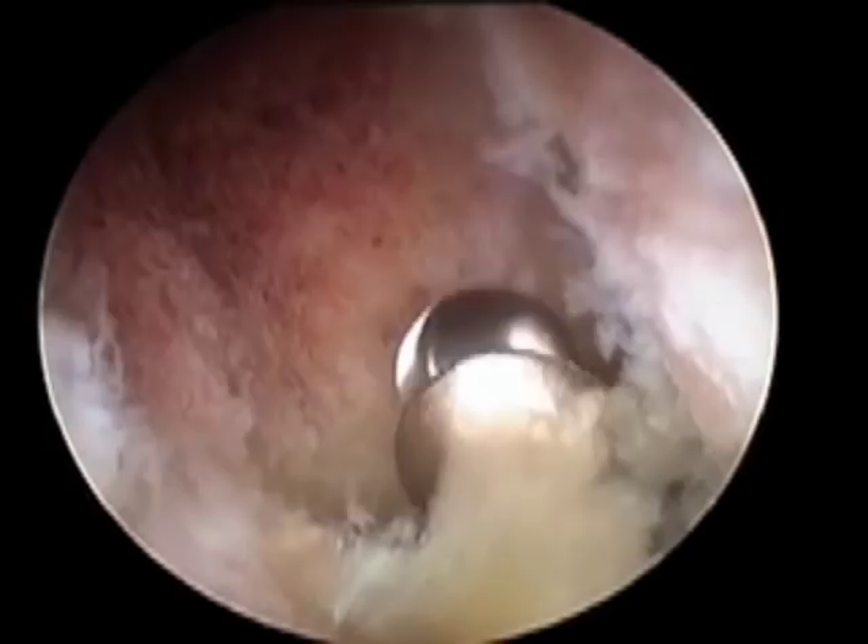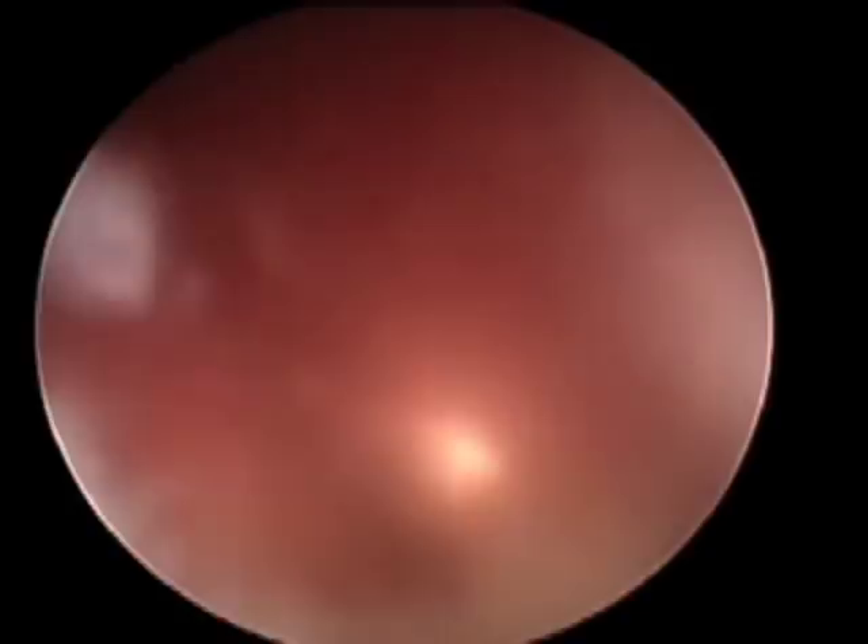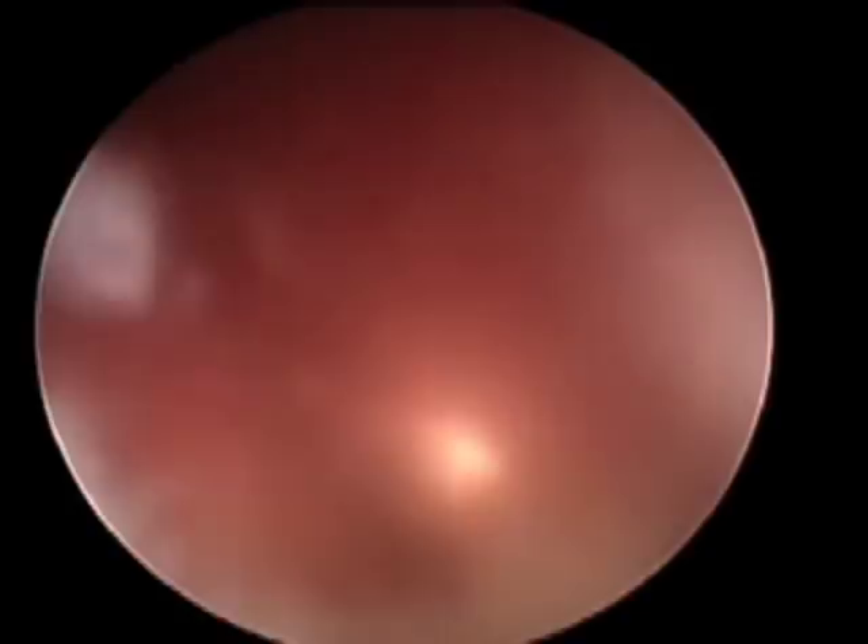This is another case where I'm resecting the end of the clavicle, and you can see one of the problems of shoulder surgery. Here is a tiny vessel, much smaller than a millimetre, towards the top of the picture, and you can see it squirting blood. This means our view is very poor. We need to bring our diathermy in, coagulate the vessel, and continue on with the operation.